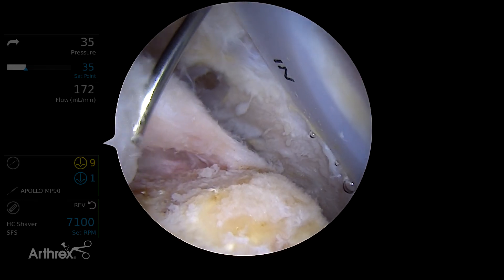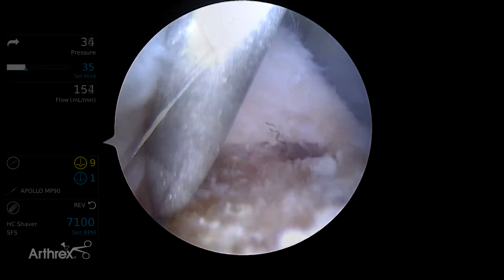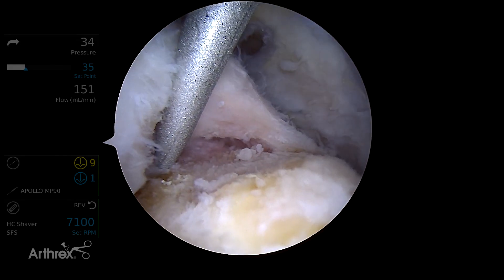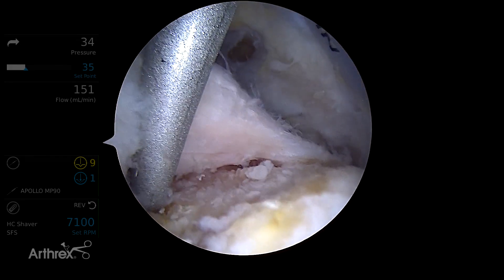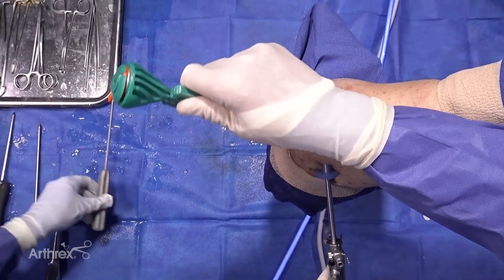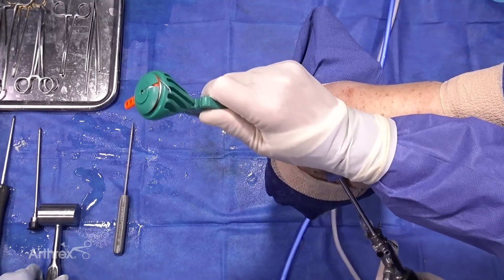We'll use a standard swivel lock punch first and we're going to go right at the articular margin and use our swivel lock punch to make a hole there. Now we'll do a quick exchange of the punch for the anchor and the inserter.